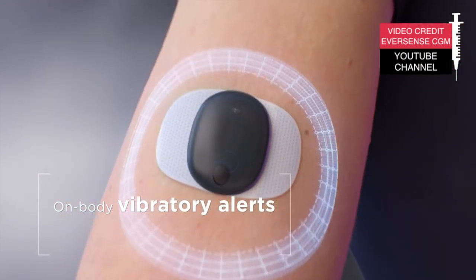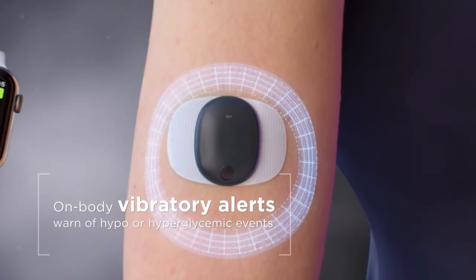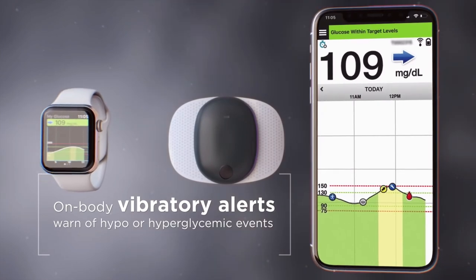The app stores your glucose data in a secured cloud location, so anyone you give access to can view your data and alerts on their mobile devices — caregivers, family, or whoever you choose. One really cool feature is that the transmitter vibrates on your body if your glucose is too high or too low, so you'll get alerted even without your phone. This is especially useful for people who sleep through alarms, since an on-arm vibration is much more likely to wake you up than a phone vibrating on a nightstand.